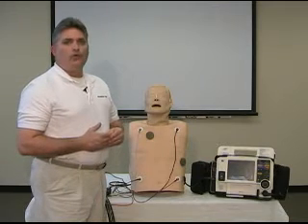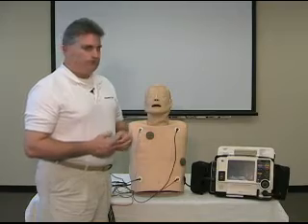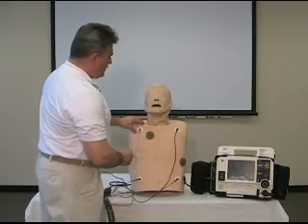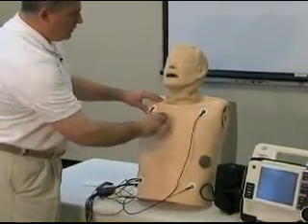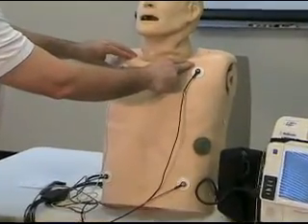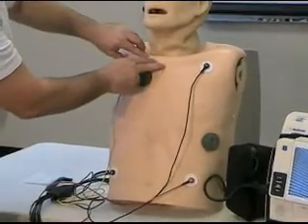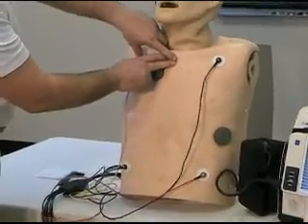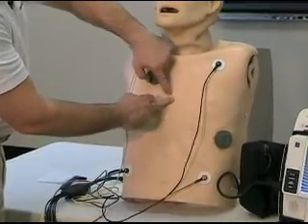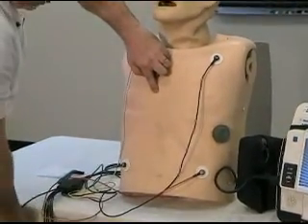Now let's look at our precordial leads or our chest leads. Those are V1 through V6. V1 should be placed first. Find the proper anatomical location of V1. Should be the 4th intercostal space just to the right of the sternal border. Simply follow the clavicle to where it meets the sternum. That is the 1st intercostal space. Come down, 2nd, 3rd, 4th. 4th intercostal space. V1 will go just to the right of the sternal border.